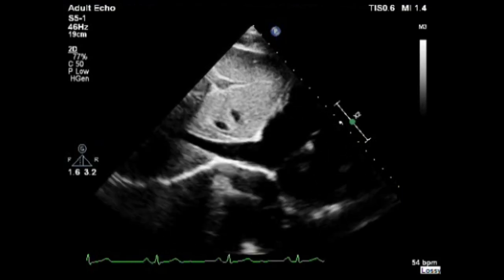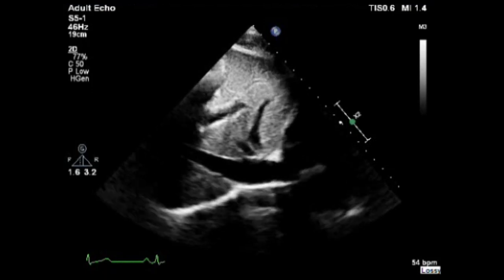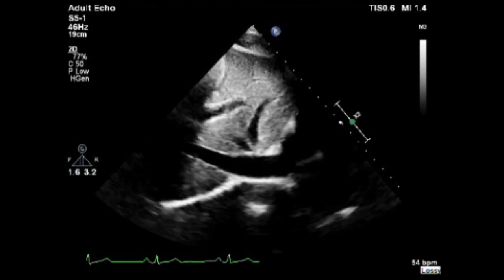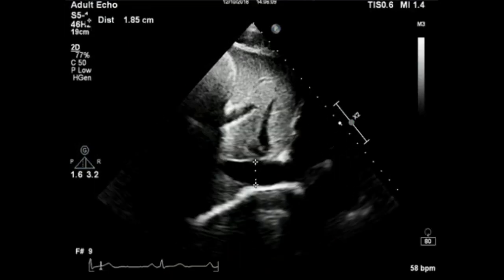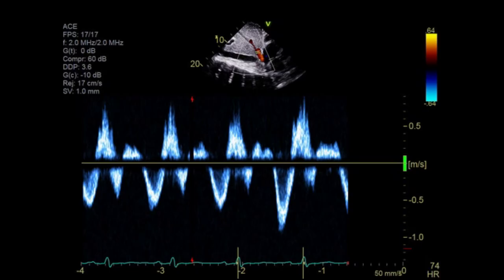Now rotate the transducer and find the inferior vena cava. Visually assess the inferior vena cava. You need to assess the IVC size and inspiratory collapse in order to estimate the right atrial pressure. You can obtain the IVC size by 2D — freeze the image and measure the diameter at end of expiration. Alternatively, place M-mode across the inferior vena cava to measure its size and assess the inspiratory collapse.